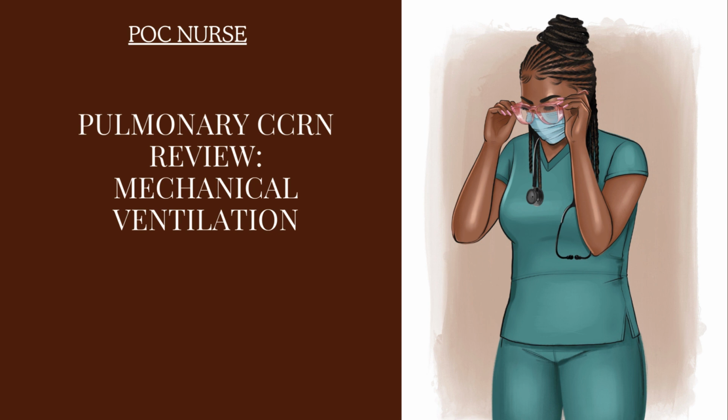Pressure support ventilation is used also during weaning a patient from the ventilator, and this is done to help reduce the work of breathing by the patient, so the patient doesn't have to exert so much energy in pulling air into their lungs. So when they trigger that breath, the ventilator will help them pull breath. The ventilator doesn't pull, it pushes. It will push breath into the patient, so the patient can now easily pull that breath into their lungs.